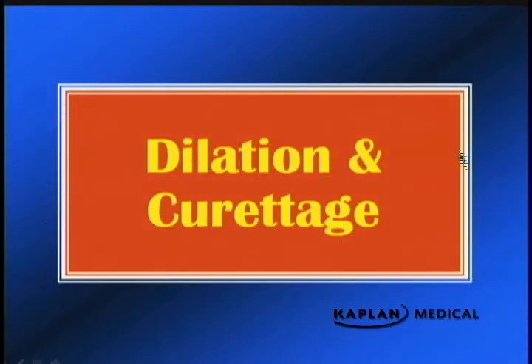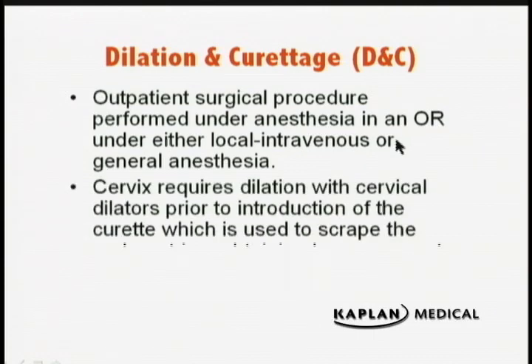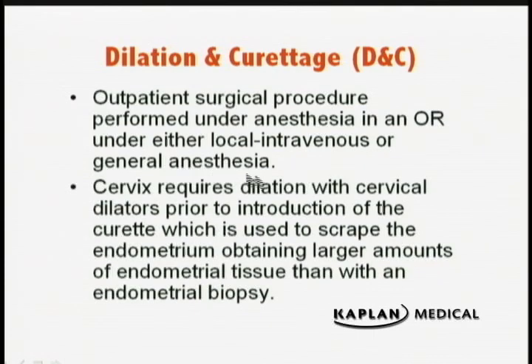Dilation and curettage. This is done for procedures which want to diagnose, and actually most of them are diagnostic procedures. This is an outpatient surgical procedure performed under anesthesia. It can be either local, intravenous, or general anesthesia, and it is done in the operating room because it can be painful. The cervix is dilated with cervical dilators prior to introduction of the curette. I'll show you that in a minute. The curette is used to scrape the endometrium to obtain larger amounts of endometrial tissue than you would get with an endometrial biopsy.